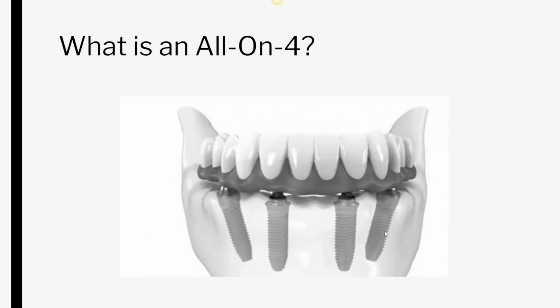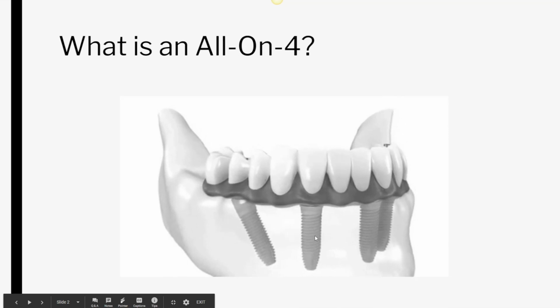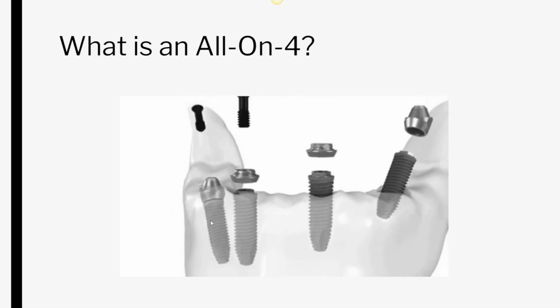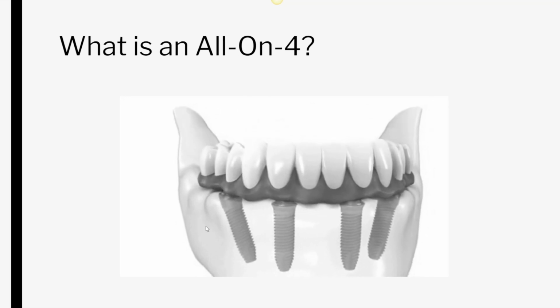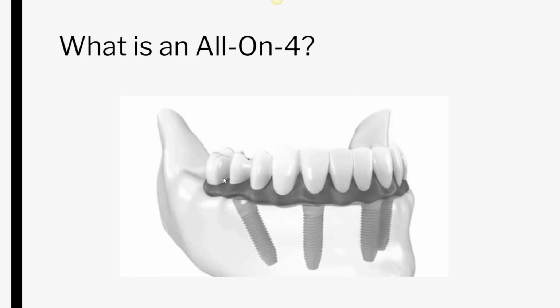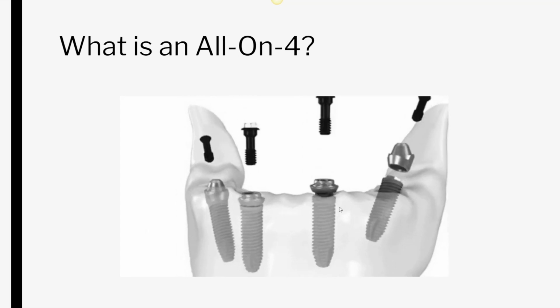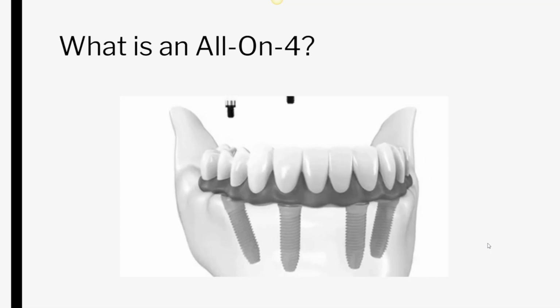These posterior ones, the back implants, are angled away so that we can create as much of what we call anterior-posterior spread, to get those implants basically as spread out as possible without hitting any vital structures such as your nerves or your sinuses, and to really spread out those implants to support this prosthesis so that when you are chewing, nothing is going to break or detach. And so again, that's basically what the whole all-on-4 concept is.